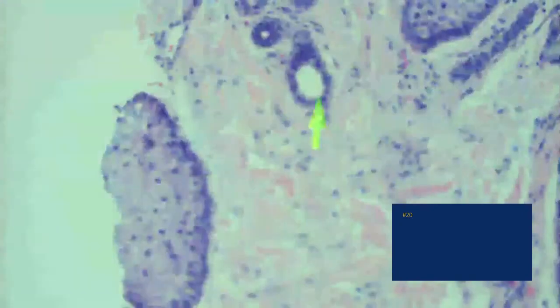Yeah. I mean, it's not stratified epithelium. It's got maybe two layers of round, some cuboidal cells. Yeah, looks like a duct or something like that. Or what's normal in skin that kind of looks like this. This just happens to be a much larger cyst that's differentiating in the same direction. Which part again? Sweat. Here's a normal sweat gland. So what do you call it?